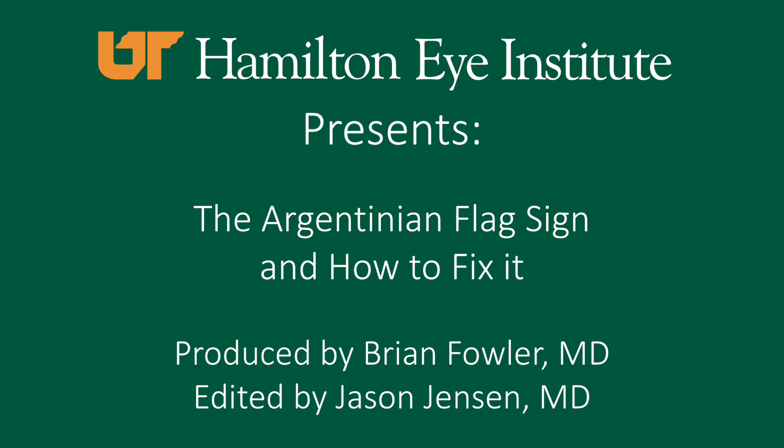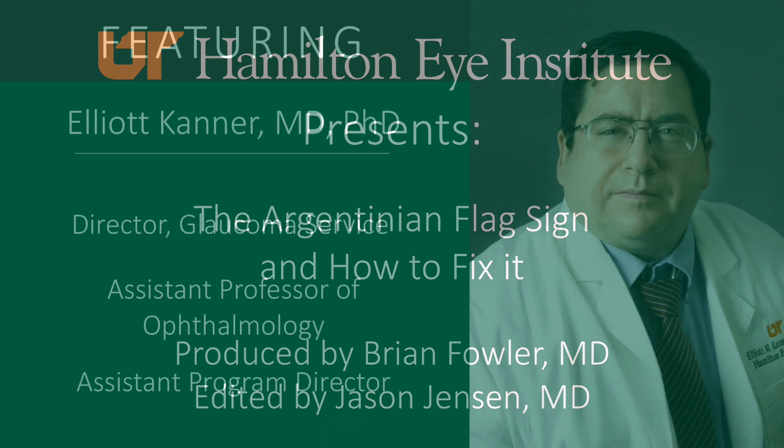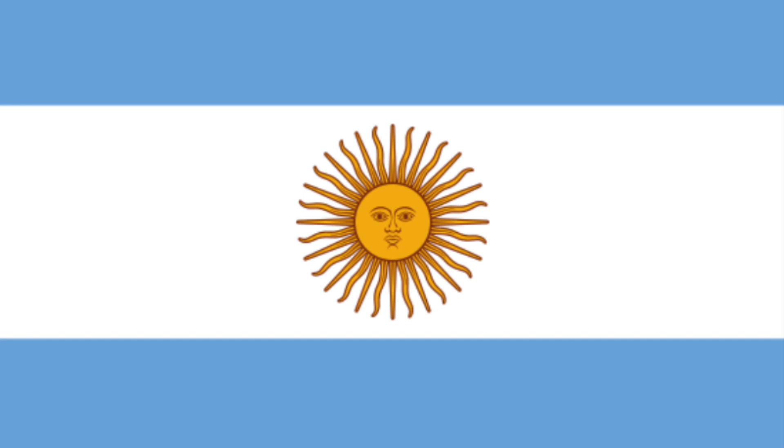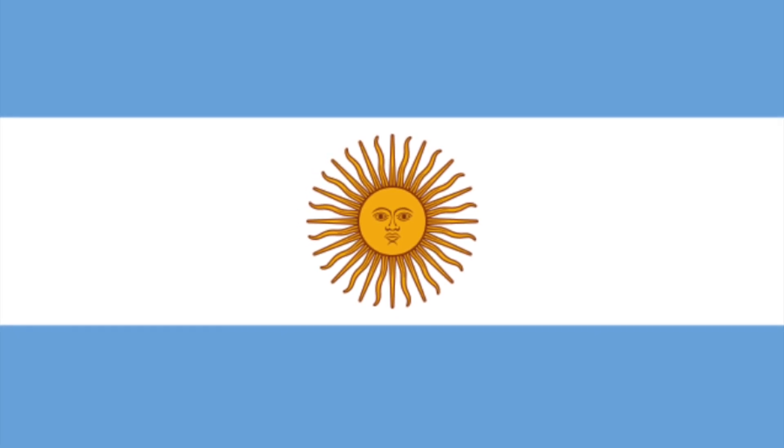In this video we will explain what the Argentinian flag sign is, why it occurs, and show one technique to fix it. This video features Dr. Elliot Kanner as the attending overseeing a resident. This surgery was performed by an ophthalmology resident and is a great learning case.